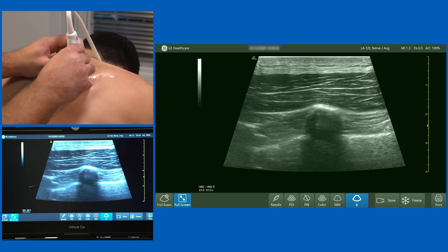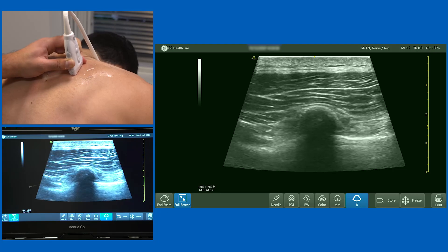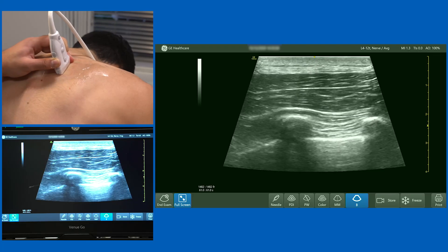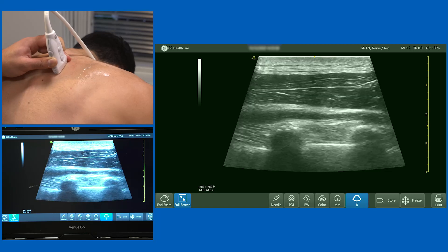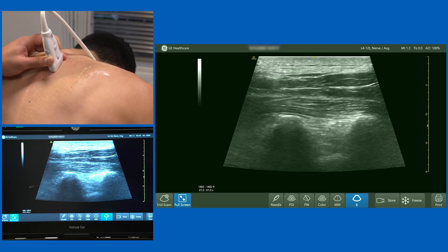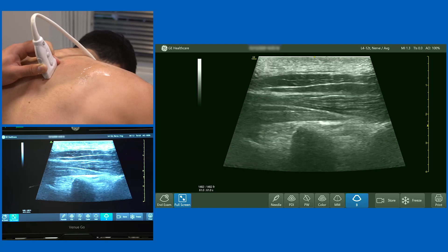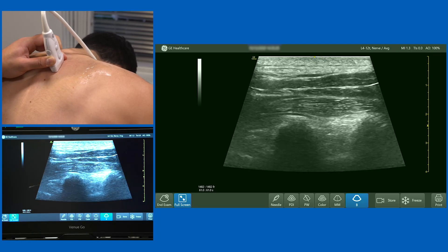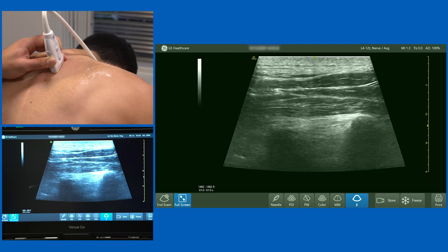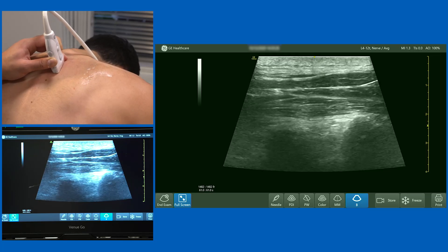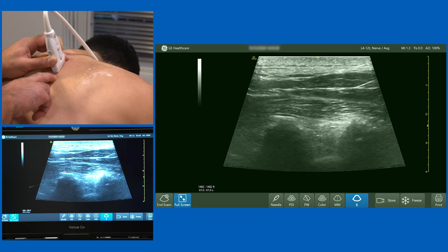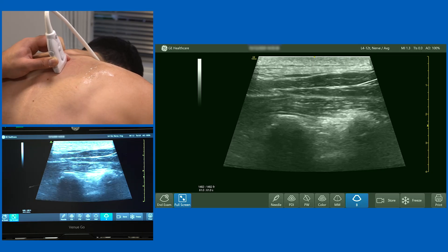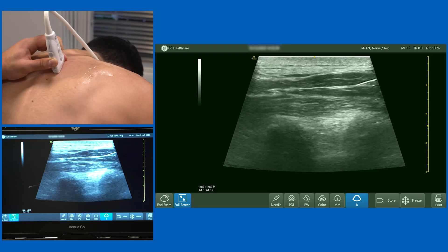I'll demonstrate again, starting laterally with ribs and three muscles — trapezius and rhomboid above. As we come towards the midline, the erector spinae muscle — a group of three muscles — starts to develop and becomes very evident. Sliding up and down the back, the aim is to identify two transverse processes and deposit local anaesthetic between the transverse processes and the fascia. If approaching from the caudal aspect, aim to come from the lower part of the probe, hit just before the transverse process, and lift that muscle up off the transverse processes.